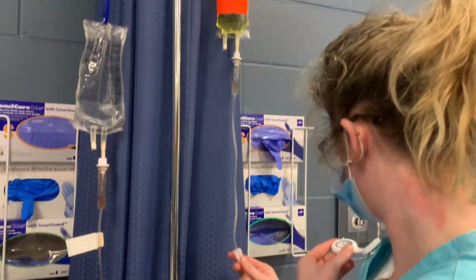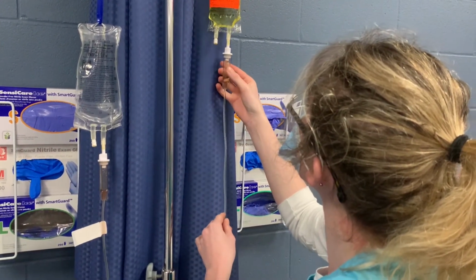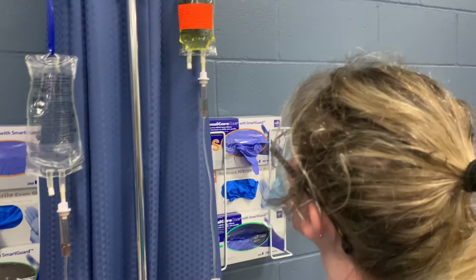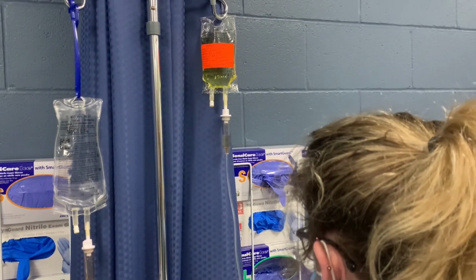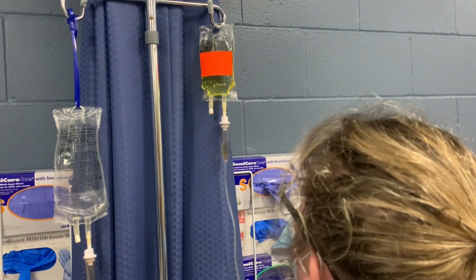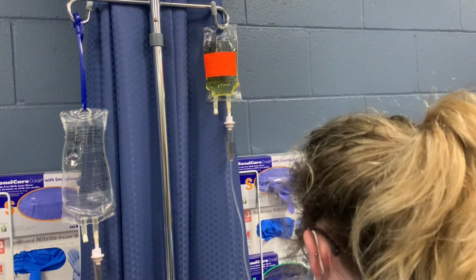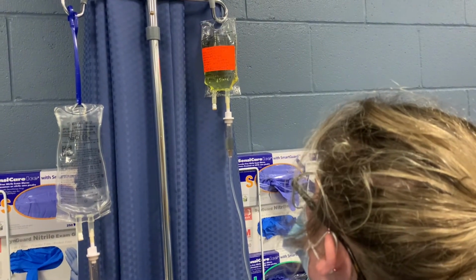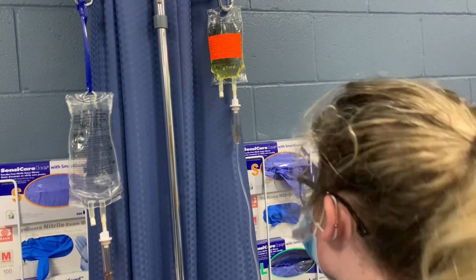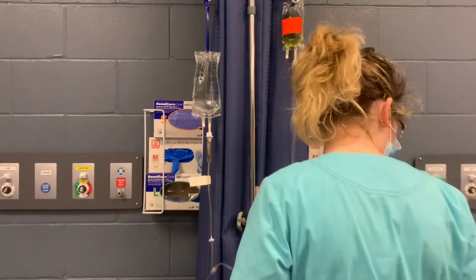So I very slowly move it open. And that's about 9 drops per 15 seconds.